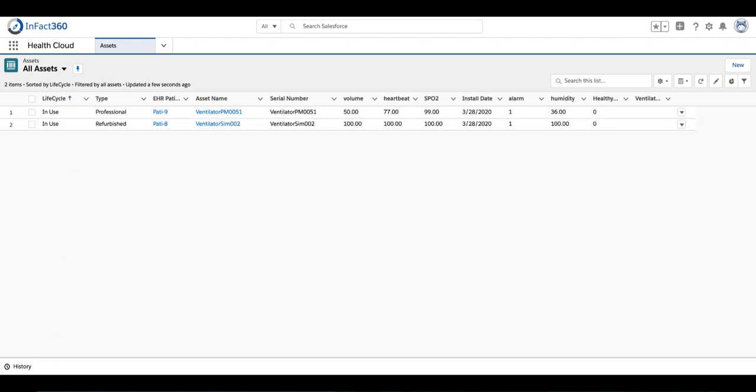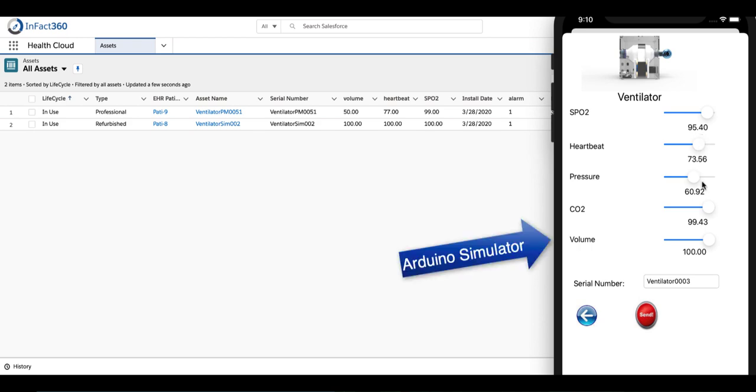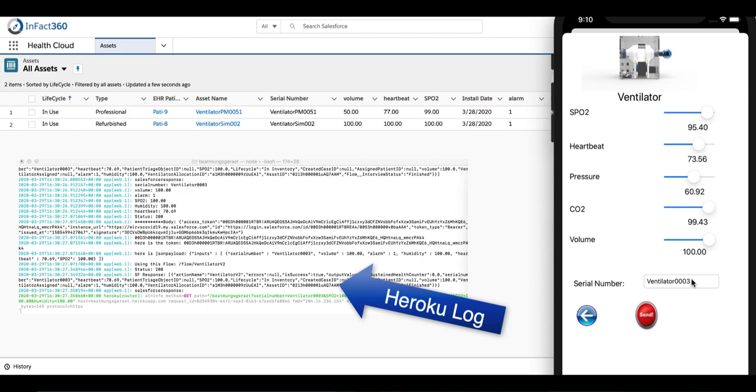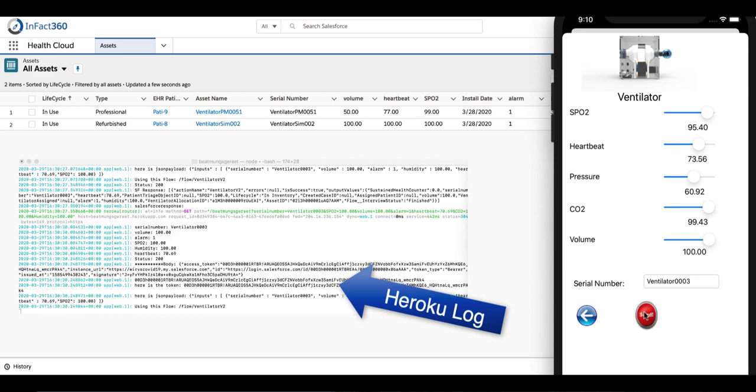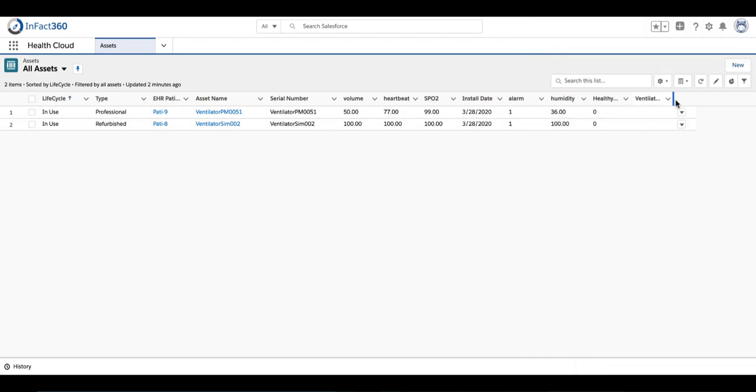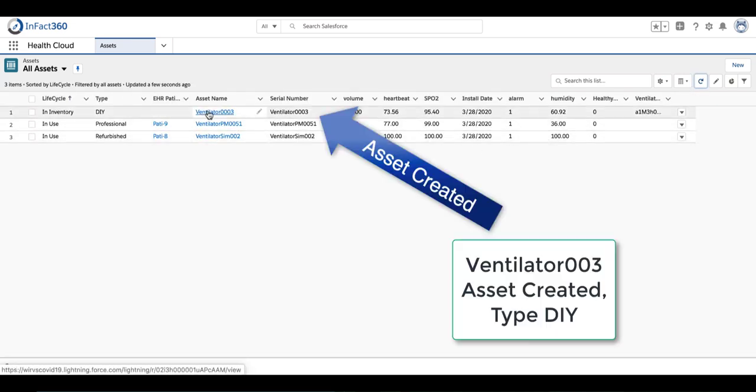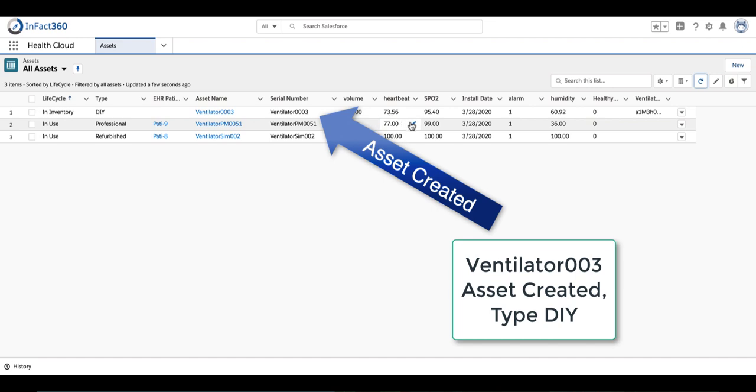We have a real do-it-yourself ventilator on the back end, but we're going to use a simulator here for this demonstration. Once I send an event in, it's going to check inventory to see if that asset already exists. If it doesn't have that serial number asset, it's going to create a new asset in the Salesforce inventory.